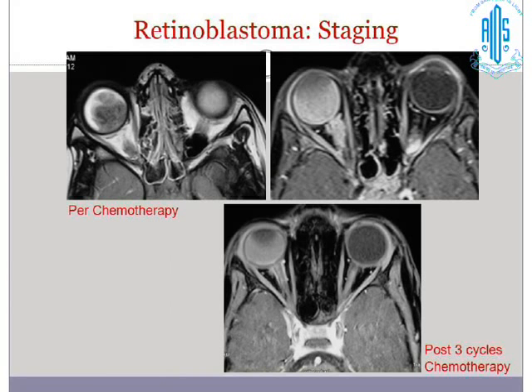Retinoblastoma staging is another very good example when we use imaging, particularly the MR. T2 weighted image, a tumor which is almost completely occupying the globe. Post-contrast T1 shows the optic nerve enhancement, pre-chemotherapy. And post-chemotherapy, one can see that the optic nerve is still involved after 3 cycles of chemotherapy, which means that it's still not ripe for surgery.